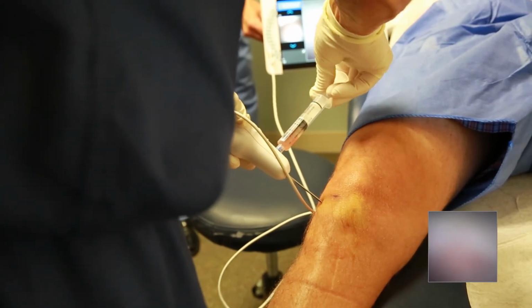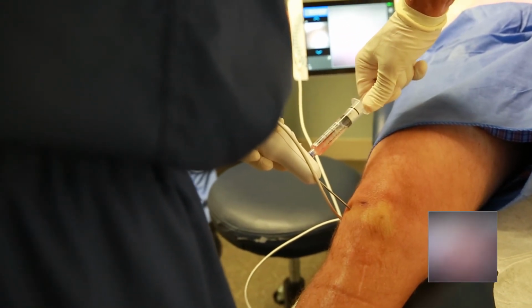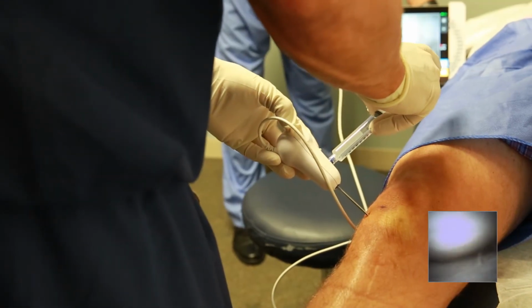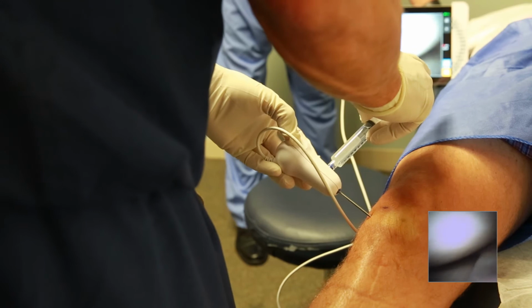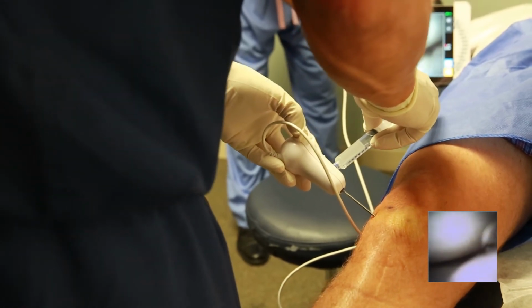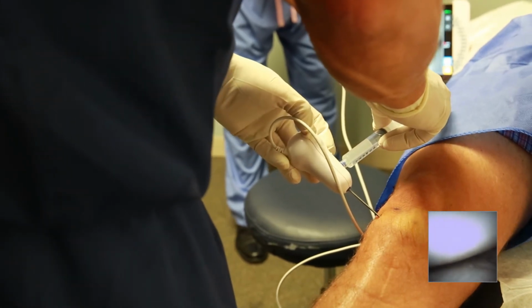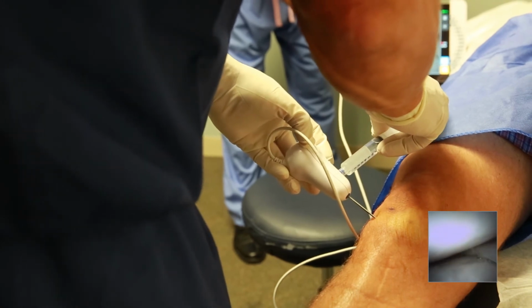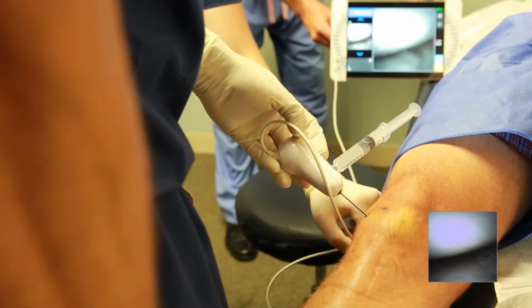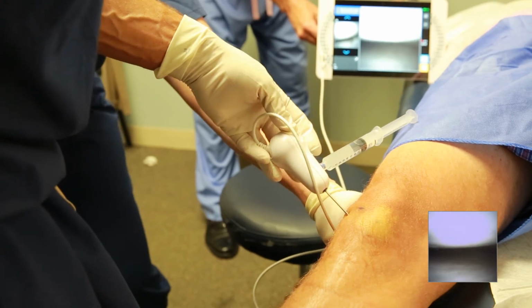Now we'll suck some of this fluid out. There's where you had a meniscectomy. Did they fix your meniscus, Jason, or did they take it out? They probably took it out. It was 30, well, it was a long time ago. 20-something. Put your hand there, please, Regina. So you see we get a pretty good look at his meniscus coming from this direction.